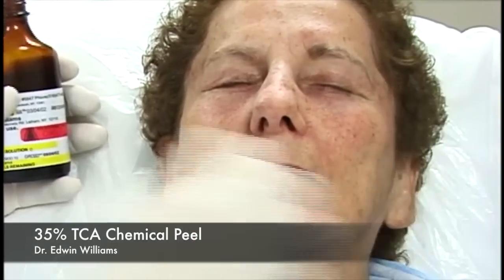In this case we're not seeing a frosting with the Jessner's, though a light frosting is not unusual. We've now completed the preparation with Jessner's solution, and we'll make sure to discard this cotton ball so we don't inadvertently pick it up when doing the trichloroacetic acid peel.